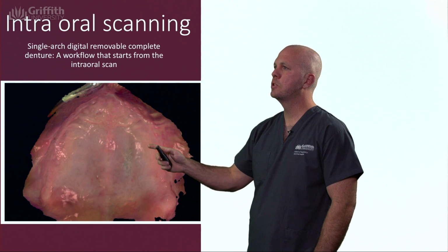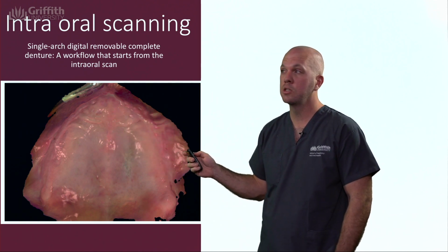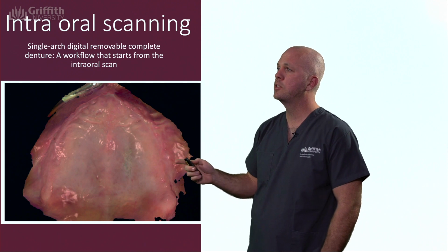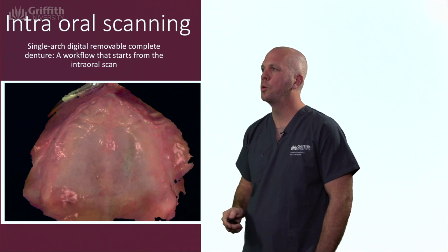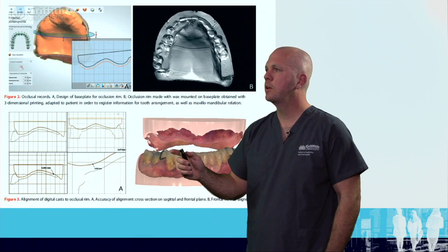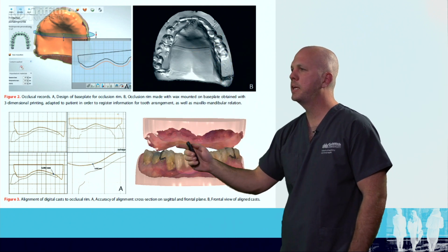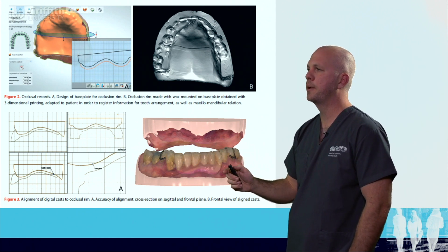This image here is from what we call an intraoral scanner. So this is our data acquisition in this instance. The patient's mouth has been scanned, basically with a very complicated photo, which then creates a colour STL image of their upper jaw. We can then see that we've orientated their upper jaw here with a bite registration, and then we can now orientate their upper jaw scan and their lower jaw scan together.